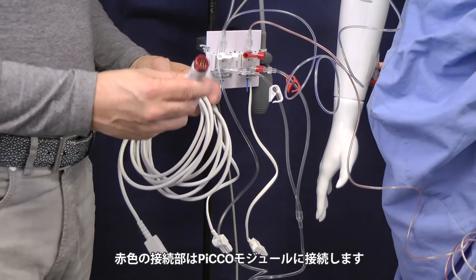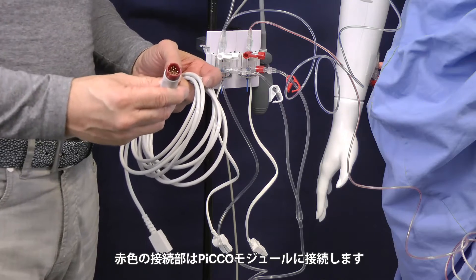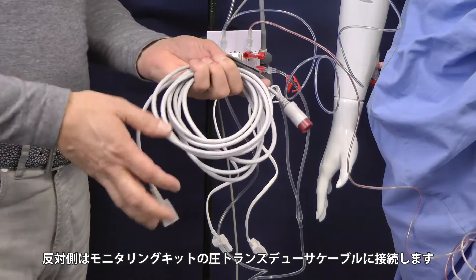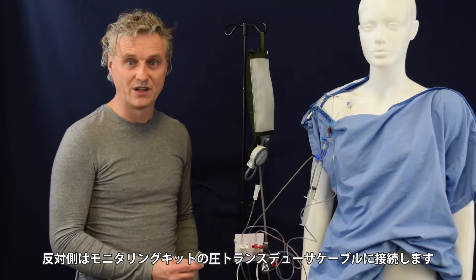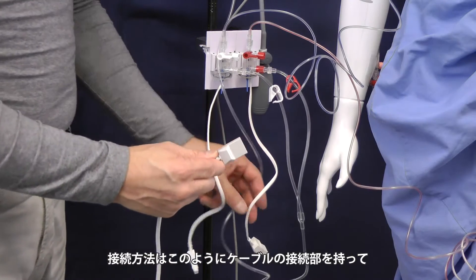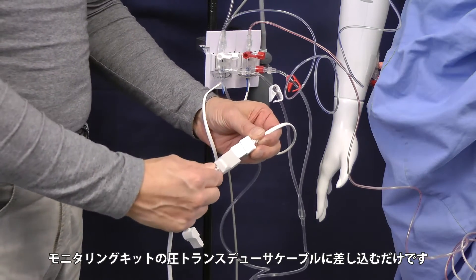This is the correct cable which goes to the entrance of the AP and the CVP on the Pico module. The other end connects to the pressure transducer. Take this connection, take the one from the pressure transducer and connect it like this.